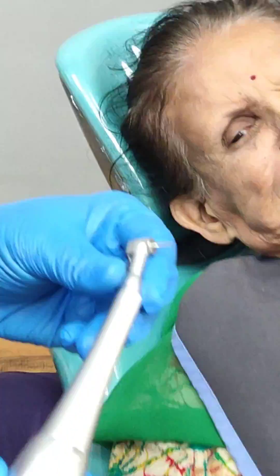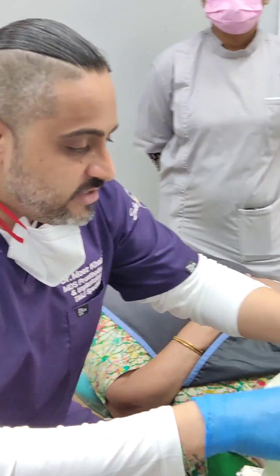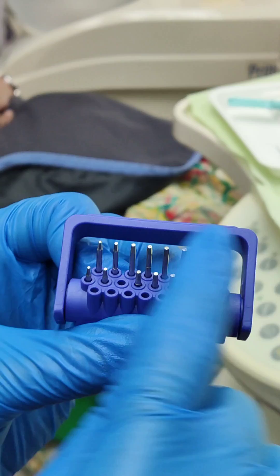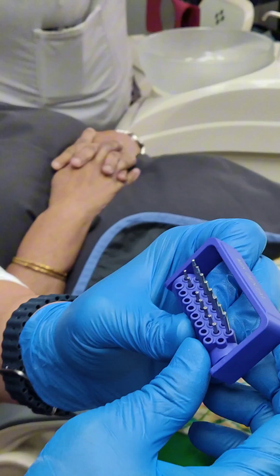It's not just the design of the instrument, but what really matters — if you look here, all different hex designs are available. There are eight long and eight short of different designs, which means you're not struggling wondering, 'I don't have the hex for this particular implant system.' No matter what company you use, this kit will allow you to tighten and loosen your prosthetic screws.